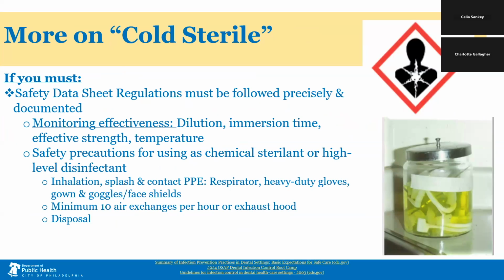If you must use the cold sterile method, safety data sheet regulations must be strictly followed. Document quality monitoring of the product, and environmental air quality monitoring must occur to prevent injury. The dilution, temperature, varied immersion time monitoring, HVAC room air exchange requirements, and safe disposal make its use complicated. Overall, buying heat sterilizable and disposable instruments is the safer course for staff and patients.